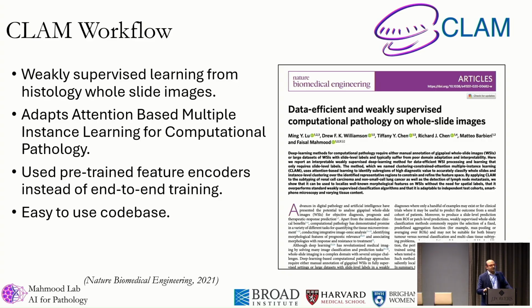But these images are very large. So from a machine learning point of view, the best way to solve the problem would be using multiple instance learning, splitting the very, very large image into smaller images, but that loses context. There are lots of issues around it.